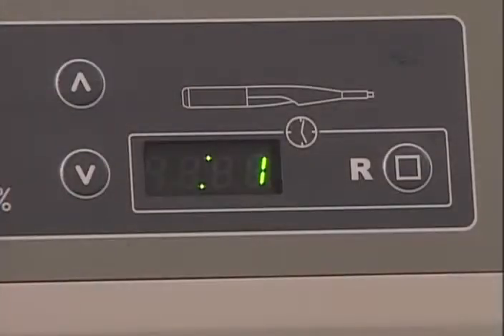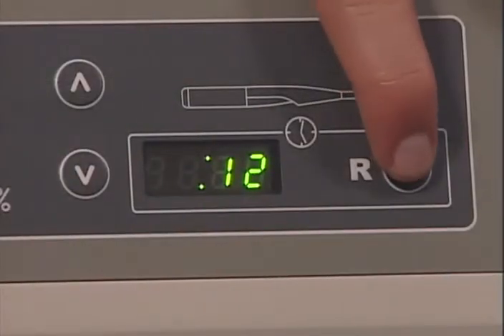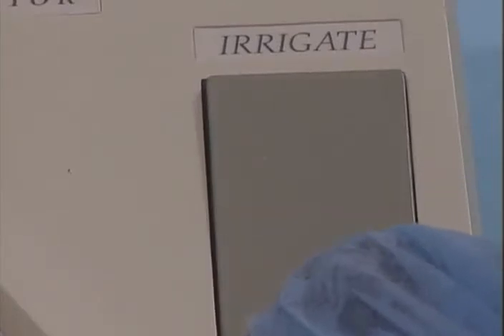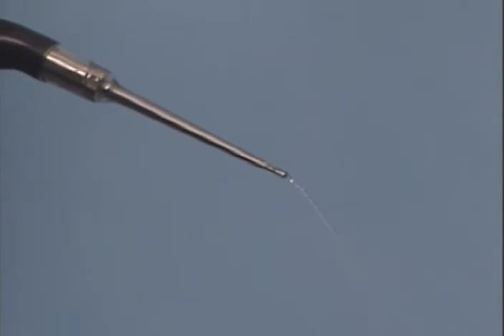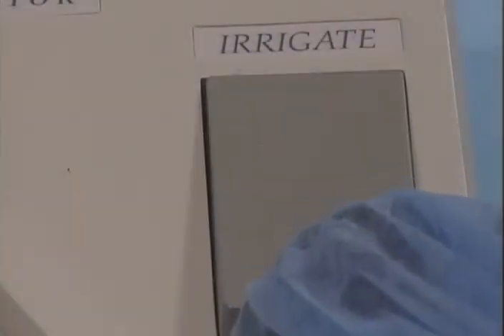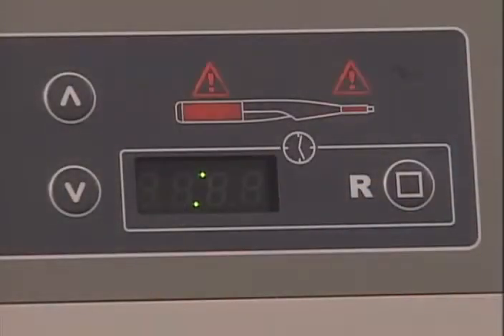When the power pedal is depressed, the timer monitors the duration of the ultrasonic power application. The time can be returned to 0 by pushing the reset button. For irrigation only, depress the irrigate pedal. Irrigation will flow from the end of the handpiece at a rate of up to 50 milliliters per minute, depending on how far the linear irrigate pedal is depressed. Should a handpiece fault occur, the red warning lights will flash and an alarm will sound.